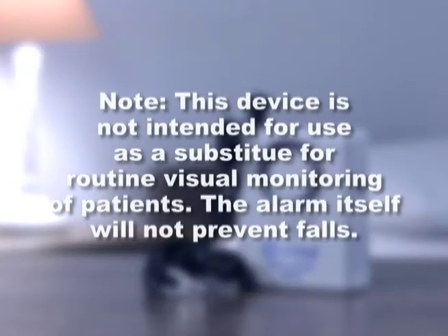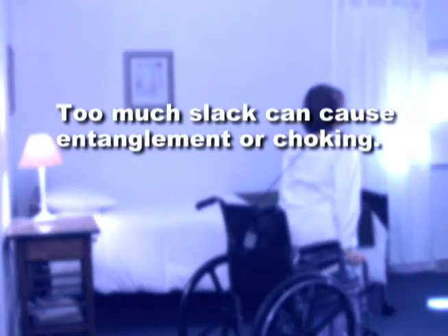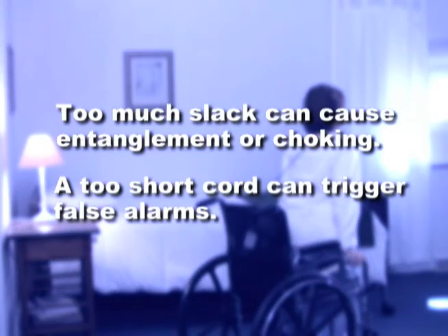Please note, this device is not intended for use as a substitute for routine visual monitoring of patients. The alarm itself will not prevent falls. Also, be cautious when adjusting your pull cord's length. Too much slack can pose the dangerous risk of entanglement and choking, while a cord that is too short can trigger false alarms.